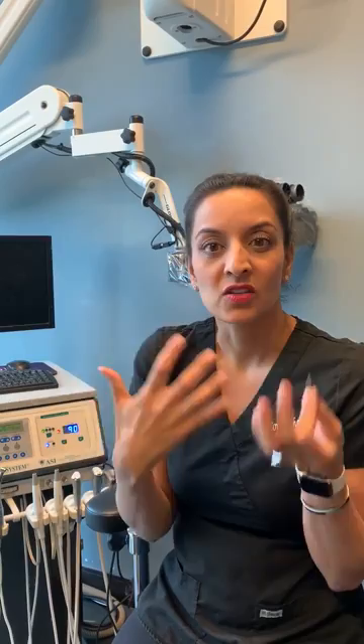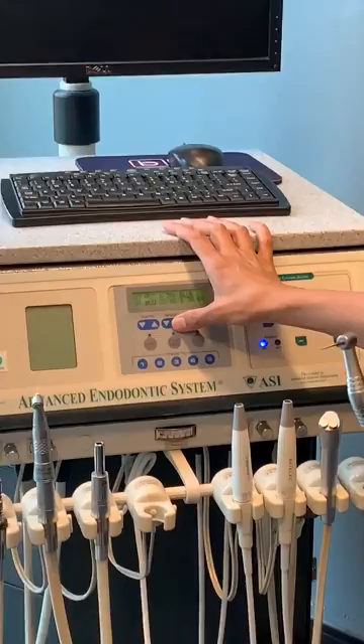I feel like the shorter ones just have a little bit more strength. When I have a retreatment, what I do is take a little bit of the gutta-percha out of each canal and make it like a little well to house your chloroform, and I let that chloroform soak in there for about five minutes to initially soften up that gutta-percha.